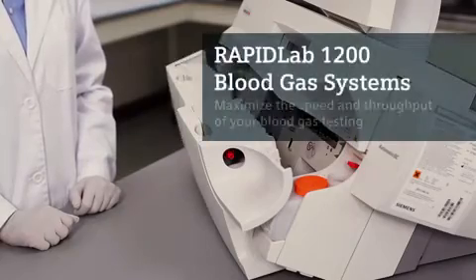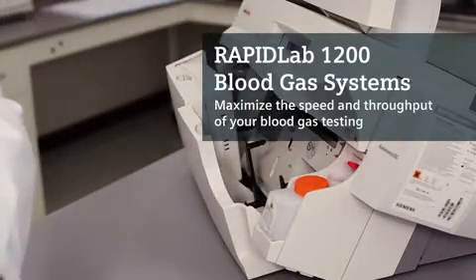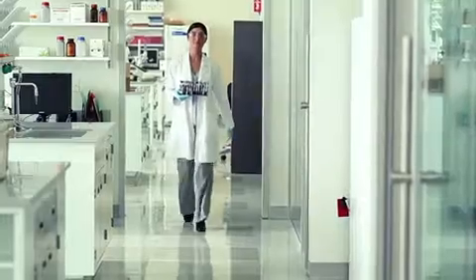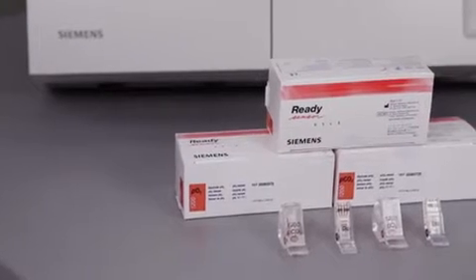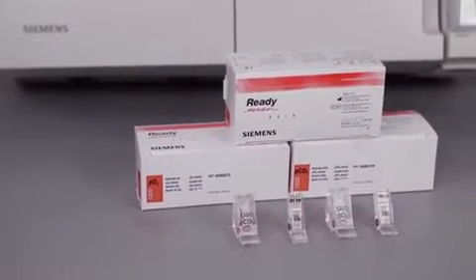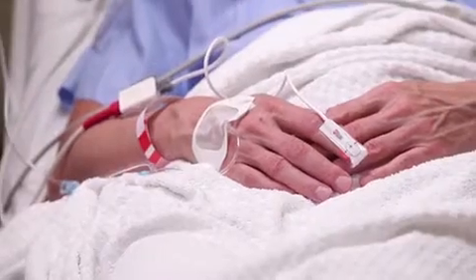The system is easy to use and consistently reliable. Cartridge-based technology optimizes operational performance, especially in medium to high-volume testing sites. With long-use-life sensors and fully automated quality control and calibration routines, operators can minimize their time running tests and spend more time treating their patients.